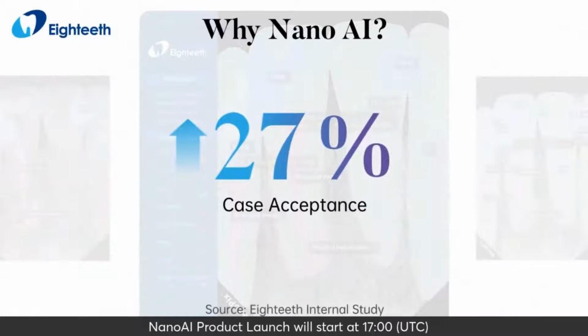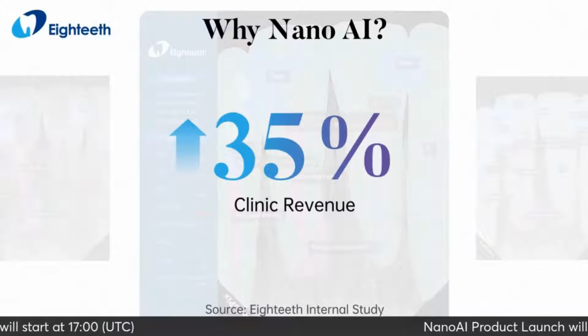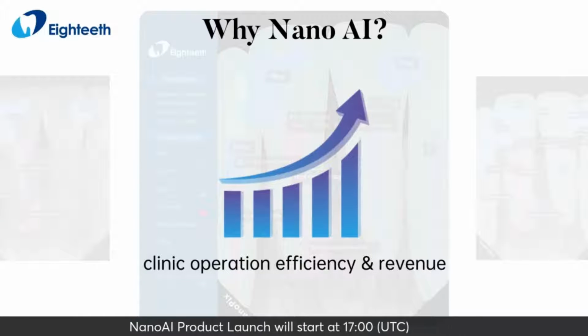With NanoAI, case acceptance can be increased by 27%. Clinic revenue can be increased by 35%. It can improve diagnostic speed, ultimately increasing clinic operation efficiency and revenue.